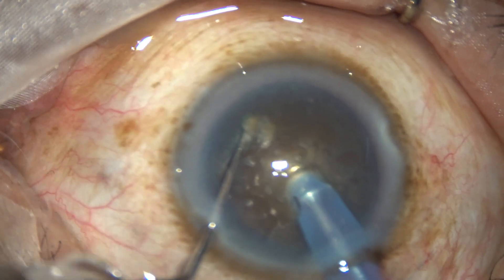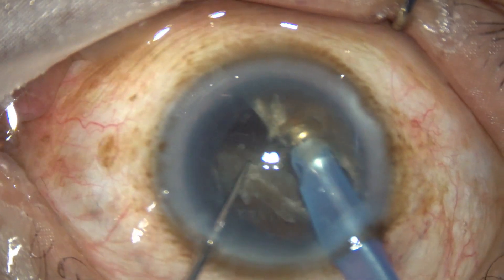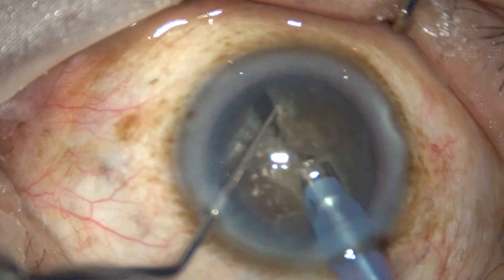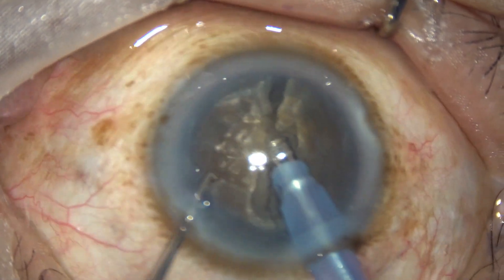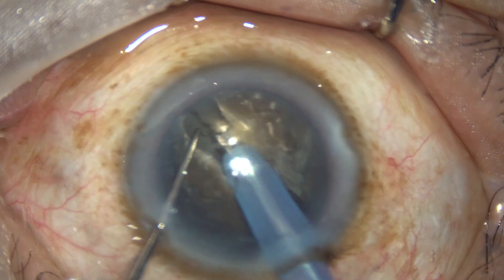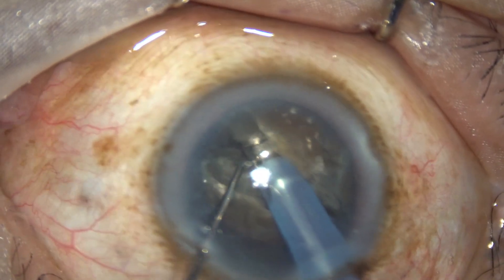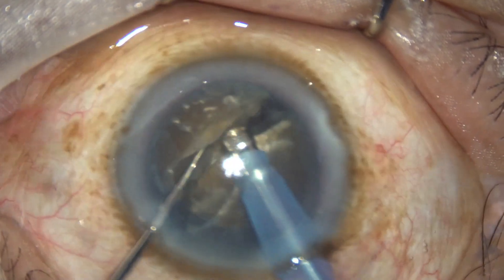As the needle reaches near the opposite equator, the chopper is used to get a nice crack. The nucleus is rotated. Some more sculpting is done to go to a deeper level, and the other side of the crack is separated.